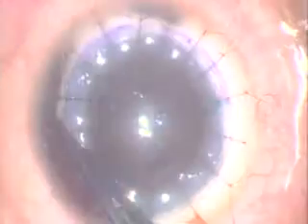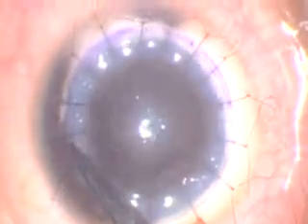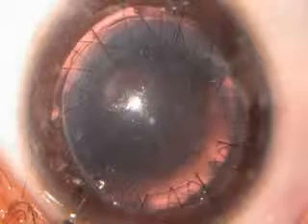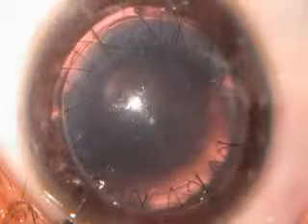Ensure that the donor tissue is then trephined with a disparity of 0.25 to 0.50 mm and the donor Descemet's membrane is peeled off after staining with trypan blue dye. Suture the graft to the host bed using 16 interrupted 10-0 monofilament nylon sutures or combined interrupted and continuous 10-0 monofilament nylon sutures. Fill the chamber 2/3 with sterile air. Finally, ensure that the graft-host junction is well opposed.